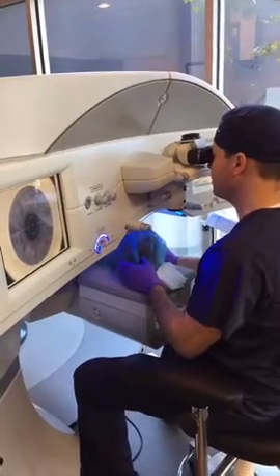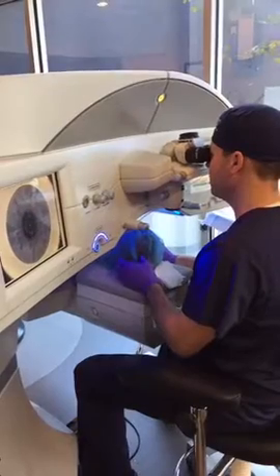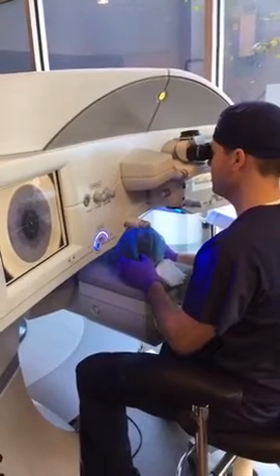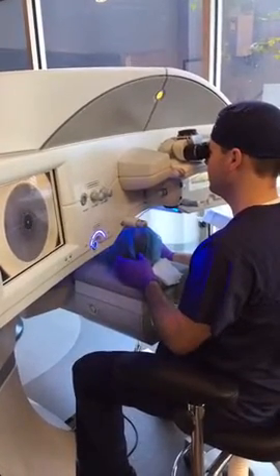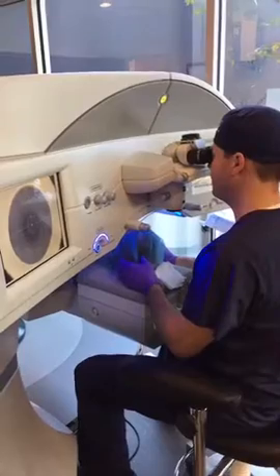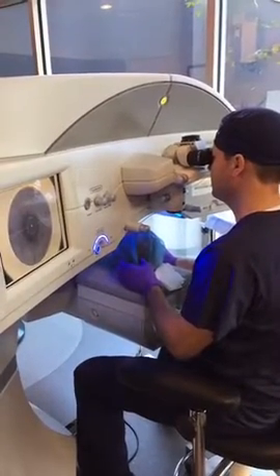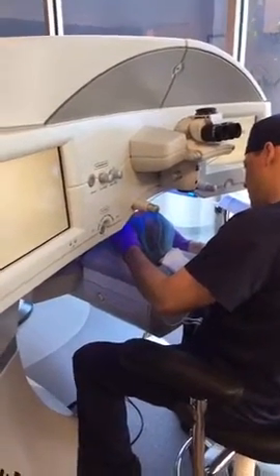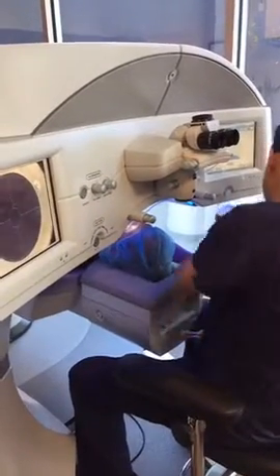Right there, just hold real still now. Everything looks great, you're doing awesome. This step only takes a few seconds. Continue to watch that green light. It's gonna get a little fuzzy now. You're doing beautiful. 6, 5, 4, 3, 2, 1. Oh, great. So the first step on both eyes is already complete. Everything's going exactly according to plan.